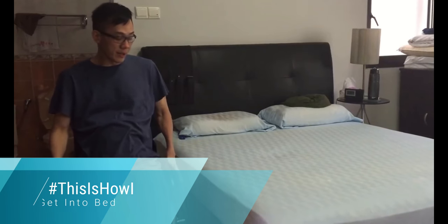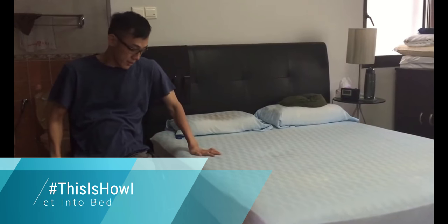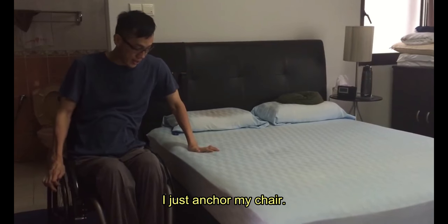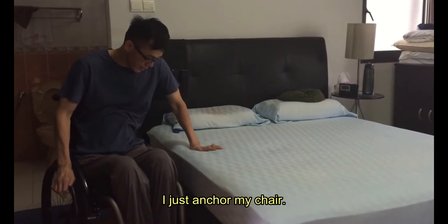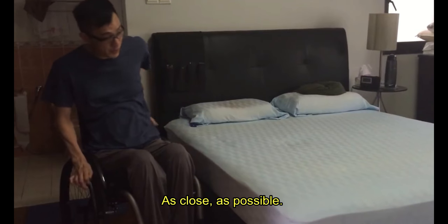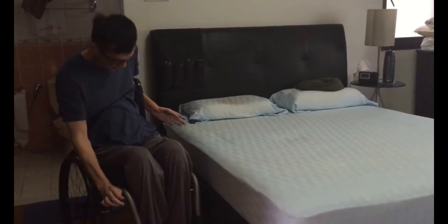So this is how I get into bed. I just anchor my chair as close as possible. He proceeds to lock his chair.